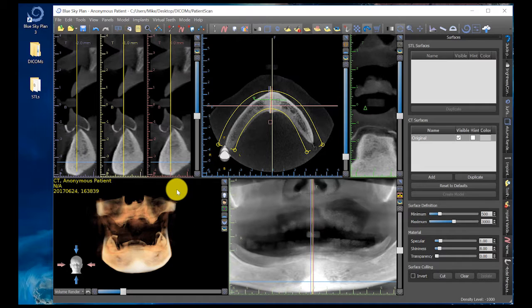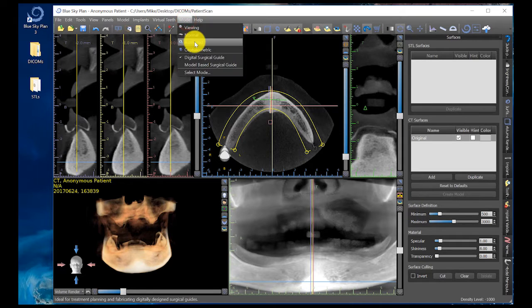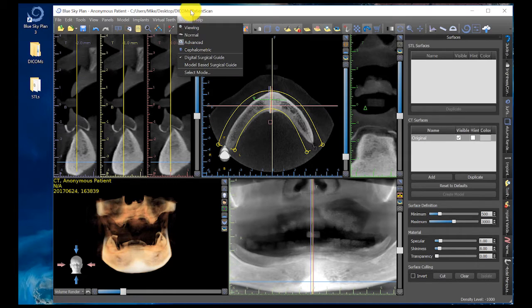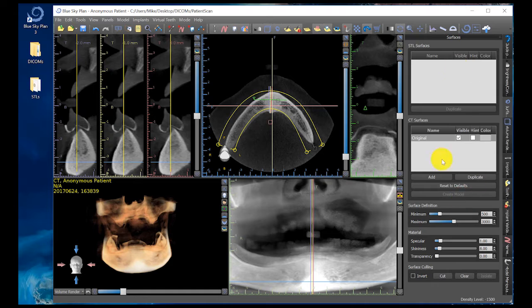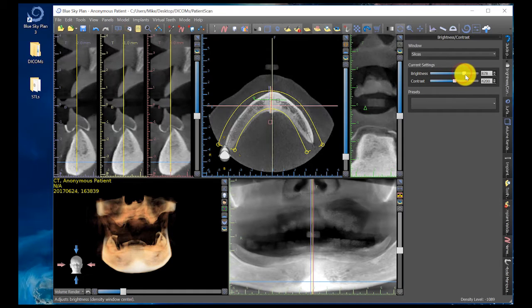First step, I like to go ahead and merge my second cone beam scan on top of this first one, but we need to get ready for that first. If you don't see the screen shown, make sure you click on Mode, Advanced. Also make sure Mode, Digital Surgical Guide is selected. You may or may not see the Panels on the right-hand side. If you click on Panels, Brightness/Contrast, it's going to give you those functions. I want to turn it up a little bit because it always needs some tweaking.